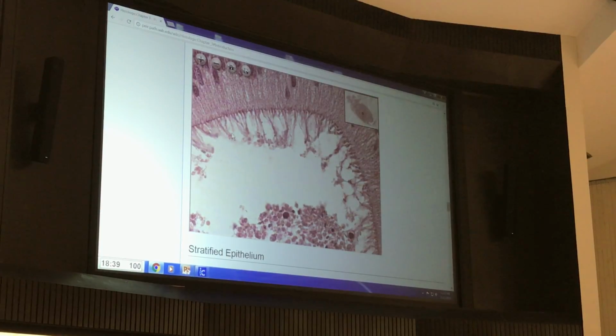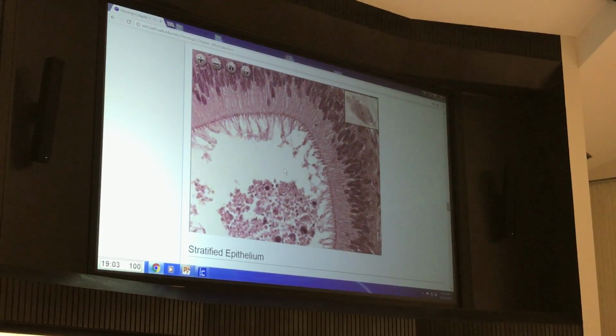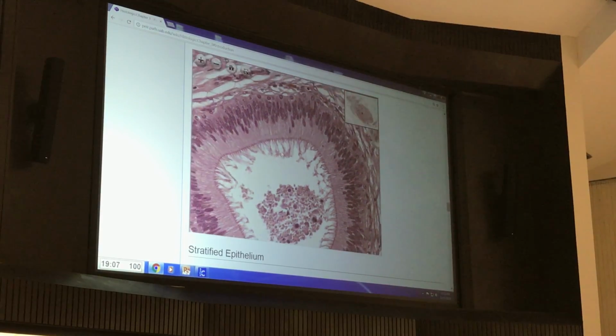Actin, right? And if cilia are to move fluids across, what's the point of stereocilia? Yeah, increased surface area for absorption. Microvilli, the same thing, increased surface area for secretion or absorption. In this case, predominantly absorption. Okay, so I think you have a good handle on the pseudostratified with cilia or stereocilia.